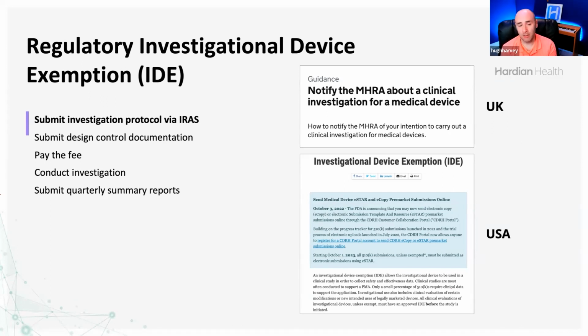What they don't like is that people conduct clinical investigations and then they never publish. That might be because the results were bad, or the trial or investigation was stopped early, but you should still publish, because this adds to the public understanding and knowledge and advances science further. Science is a series of experimentation, and not all experiments work. And it's important to learn from when it doesn't work. So please do publish your results.